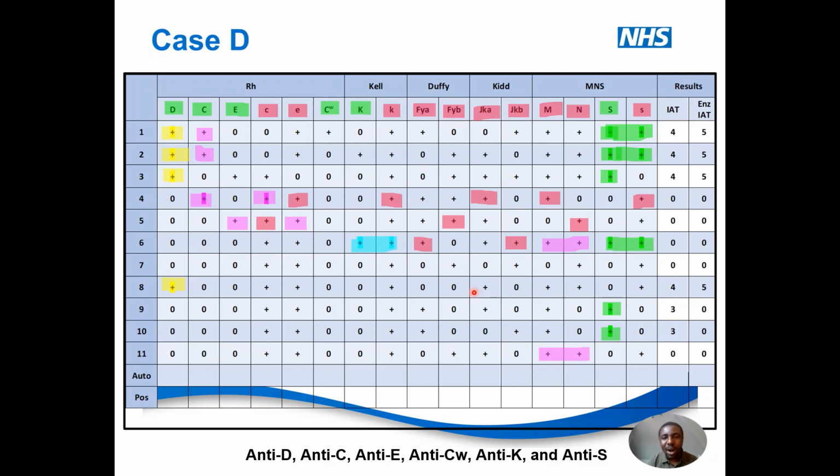So you can work it out from what I've said. Excluded is where it is homozygous and it is positive and the patient sample is negative. Let me also give you another example like M. I could not exclude M in cell number 6, M and N, because they are heterozygous here, even though this is negative. The same thing with S. I couldn't exclude it in cell number 6 because it is heterozygous here with small s.